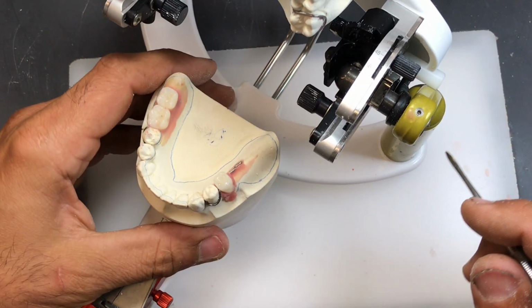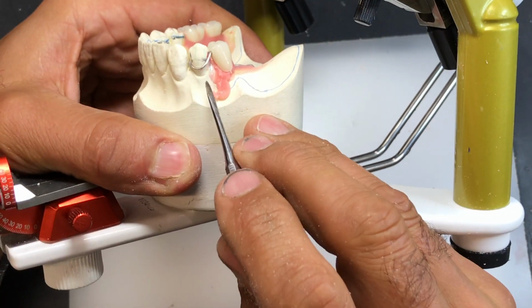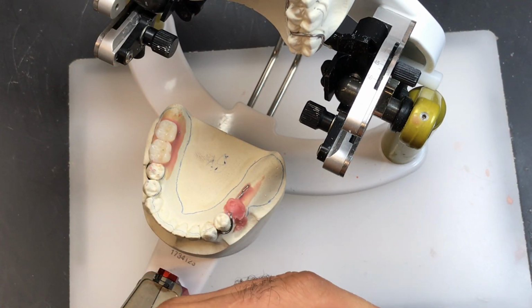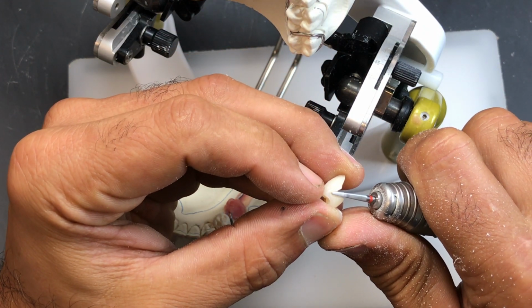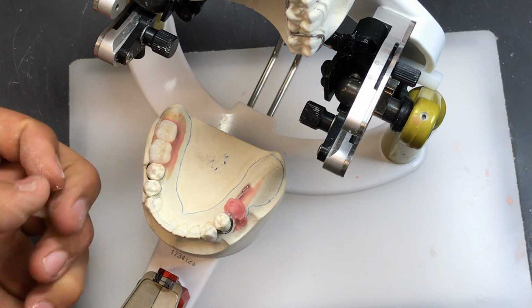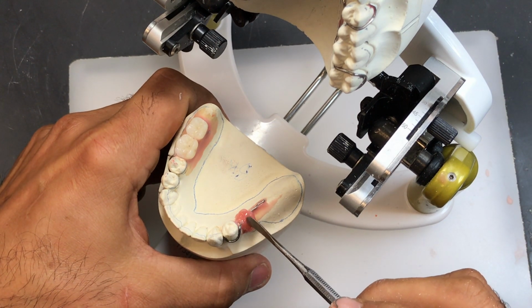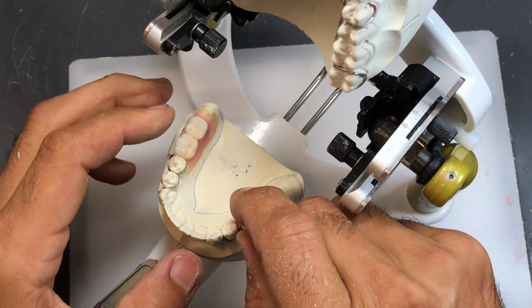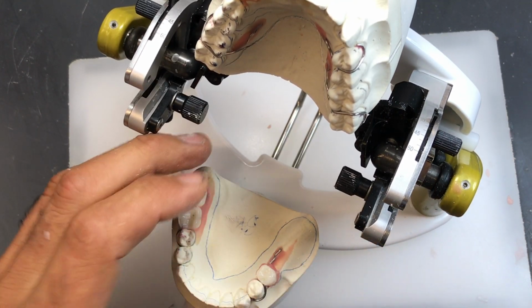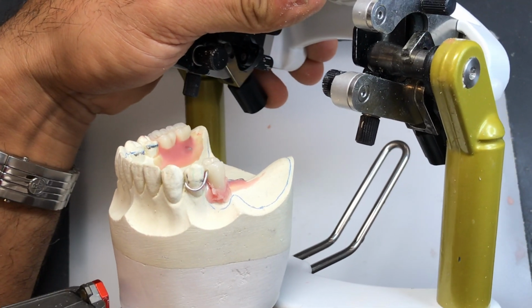I'm still getting interference. Just where I thought I put the tooth in an ideal position, I'm still getting interference right there. So I need to grind that tooth just a little bit more, not too much. Right there. Let's see if that makes a difference. That looks pretty good. So I've ground just enough from the tooth surface to go around that wire.